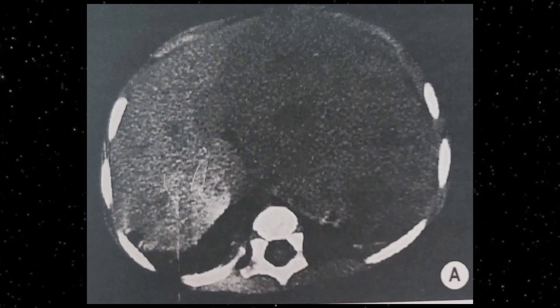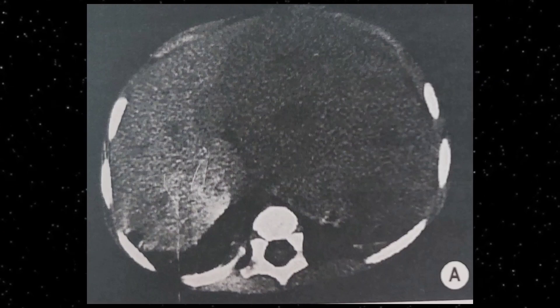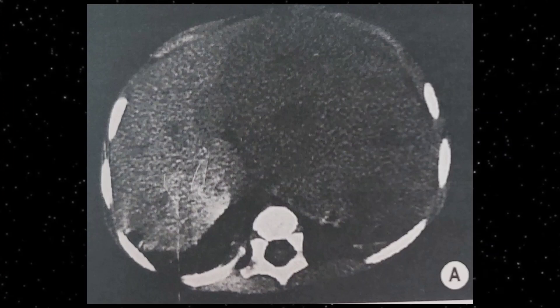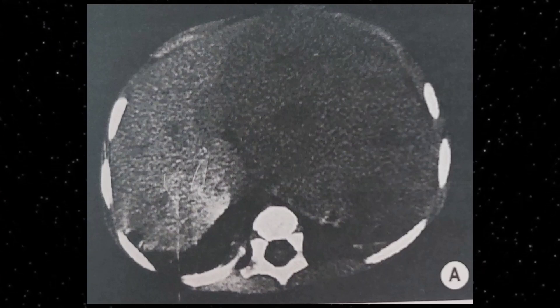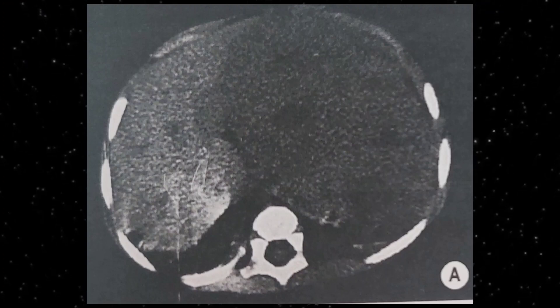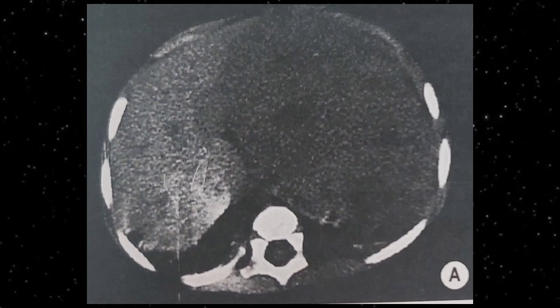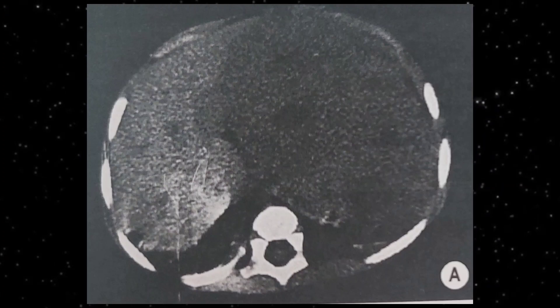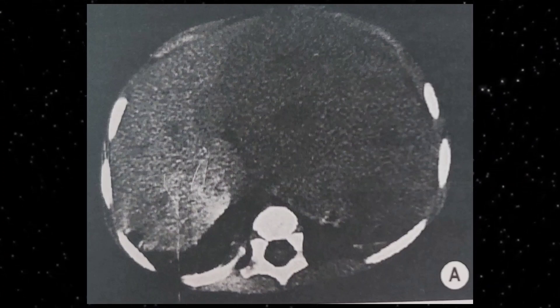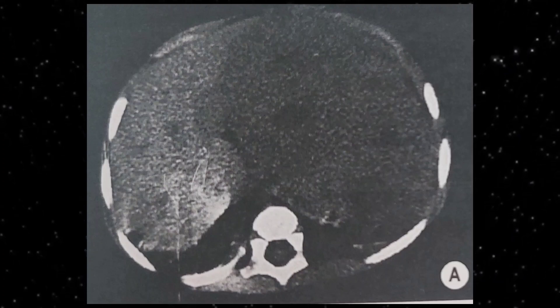This CT scan for hepatoblastoma shows a well-defined, large, low-density, solid, heterogeneous mass without calcification. You can appreciate patchy enhancement. The patient was 17 months old. On the patchy enhancement, there may be central necrosis or degenerative changes. You need to look at the CT density to differentiate between soft tissue and cystic components. This is one example of hepatoblastoma on CT scan.